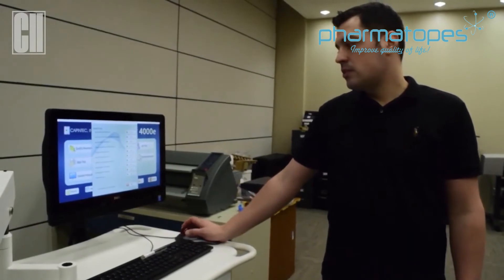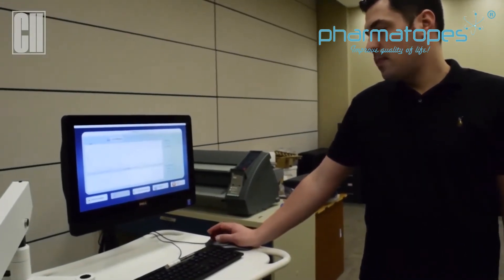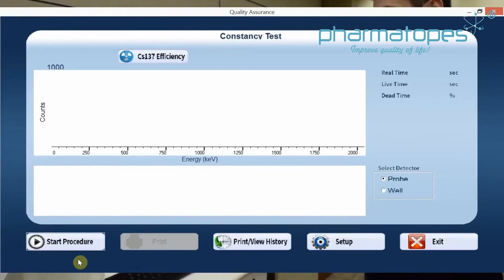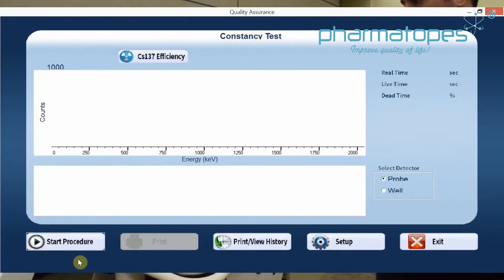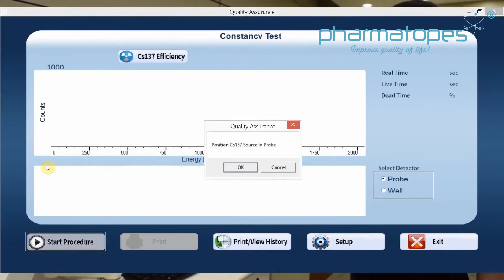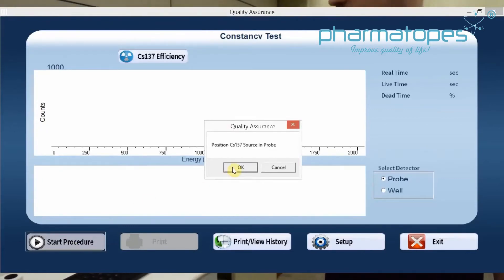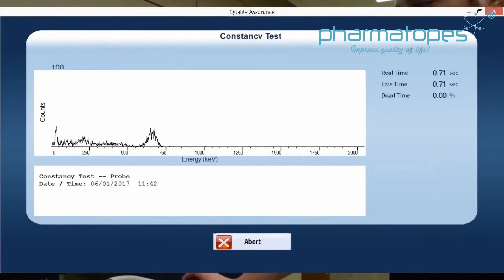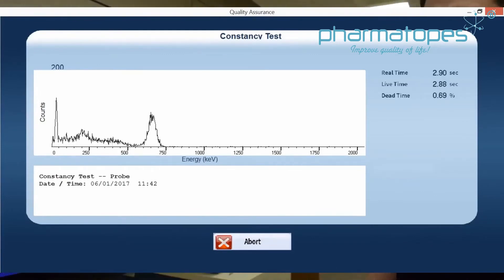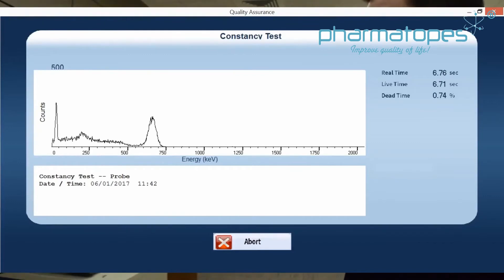The next step is to perform the constancy test. We'll go to that location. Select the detector you'd like to check, and then do Start Procedure. It's telling us to position cesium in the probe, which is already in there at this point — click OK. We want our deviation to be plus or minus 5% for a successful constancy check.